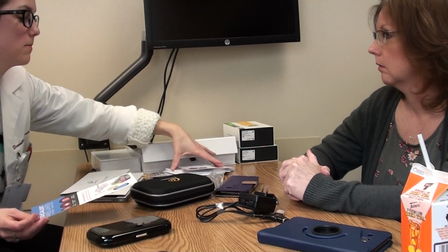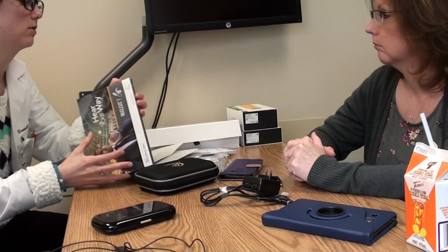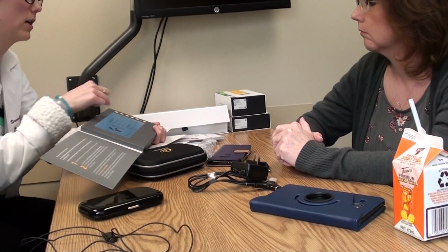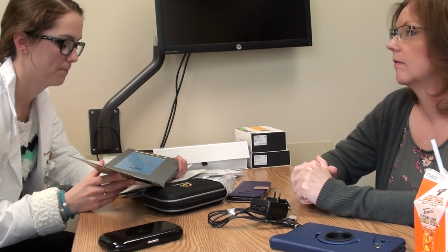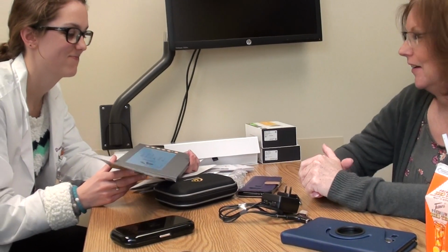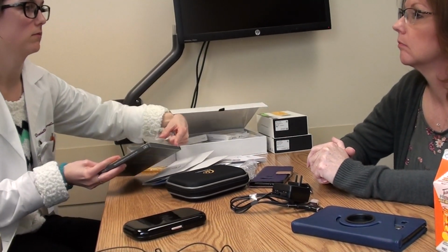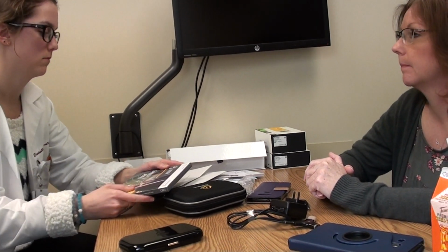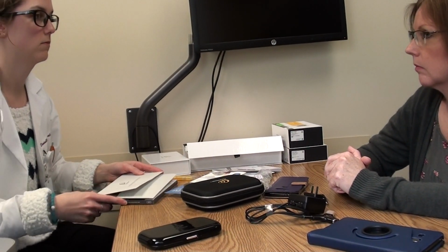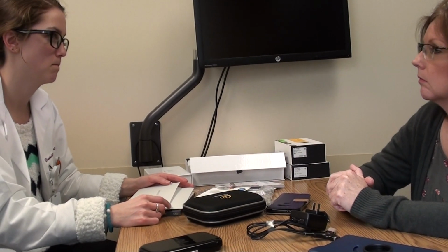And then you have a couple of user manuals here that will have everything we talked about today. And then this little user manual is a screen that you can go through for different things. Oh, I take that home with me? Yeah, that's yours. It has videos on how to use it and all kinds of stuff, so it's a good thing to go through. It's a little iPad mini, and the charger is in that white box if the battery dies. The little tan cable in there charges it. It's preloaded with video tutorials on how to use all of this. You're probably not going to learn anything there that we're not teaching you right now, but it's good to go home and review so you're familiar with the products and how to take care of them and use them.